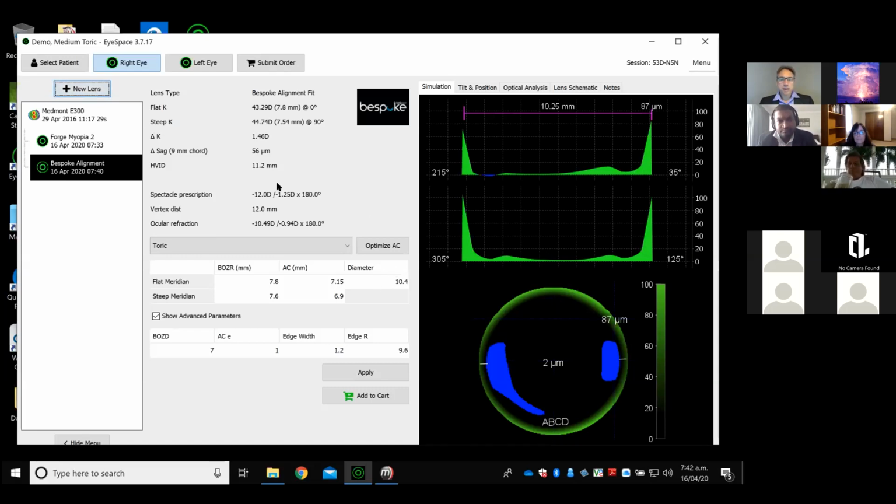The problem with going with large optic zones on GP lenses is there's a higher risk of the lens suctioning onto the cornea or adhering to the cornea. So by keeping the optic zone at a basic 7 millimeters, we can enlarge the lens to fit a bigger percentage of the cornea, and that difference in size is taken up by the alignment curve.